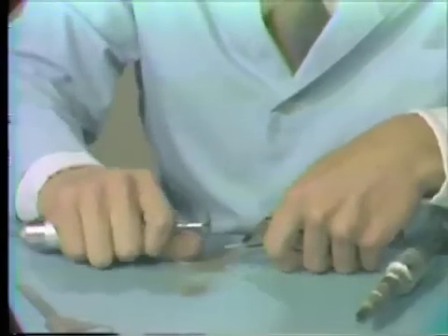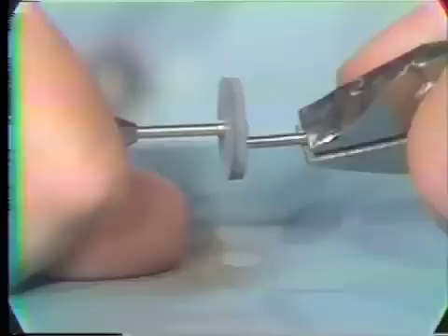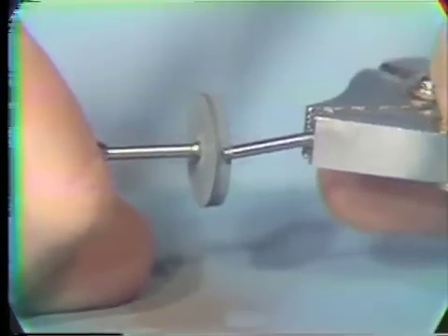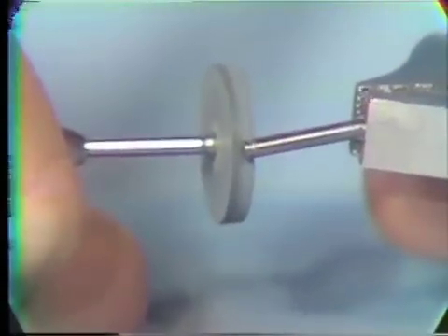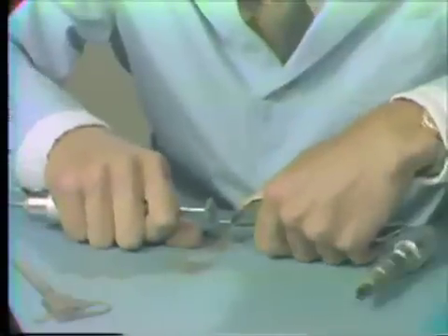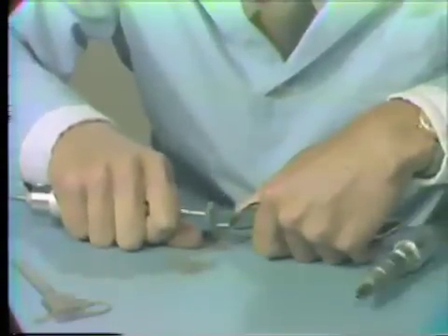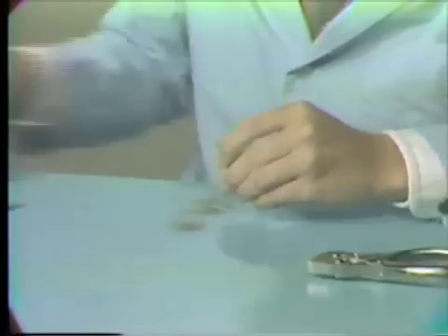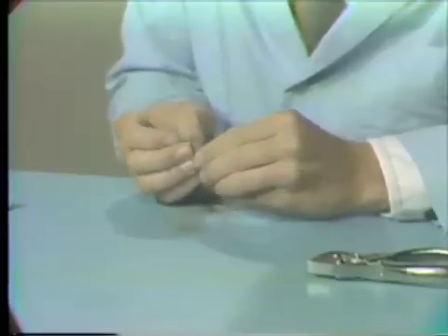You can either hold the burr in the pliers or leave it in the electro-torque as before. Cut in the groove with the heatless stone. The approximate depth to grind to is when the flat spot being ground approximates the depth of the cut that was originally made. At this point, check the flat spot that you've ground against a commercial burr.